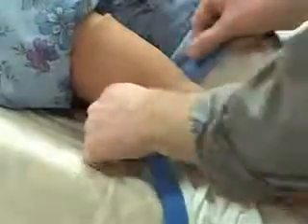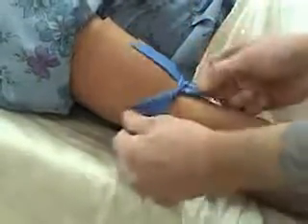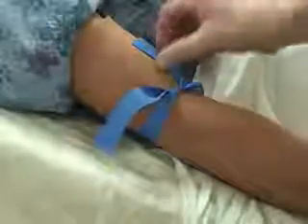First, tie the tourniquet on the upper arm. This causes the veins to swell slightly, making them easier to find. Be sure to tie the tourniquet so that it can be released easily with one hand.